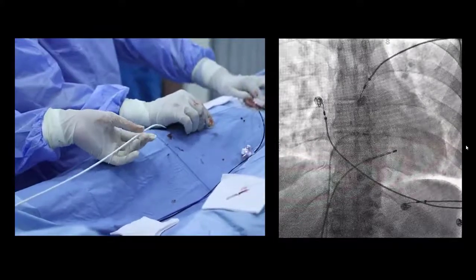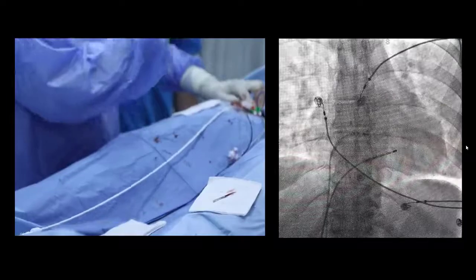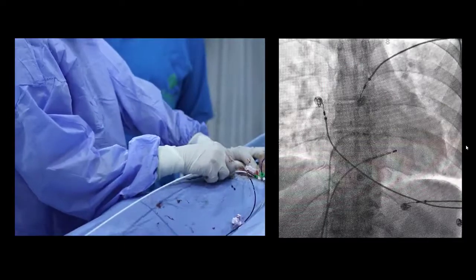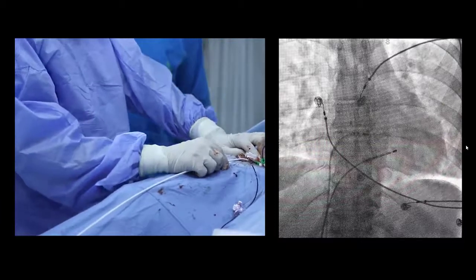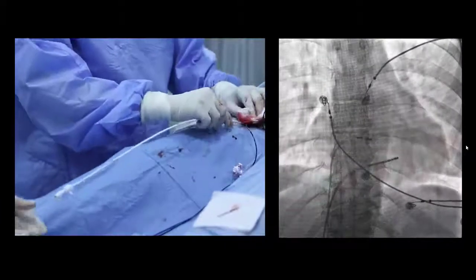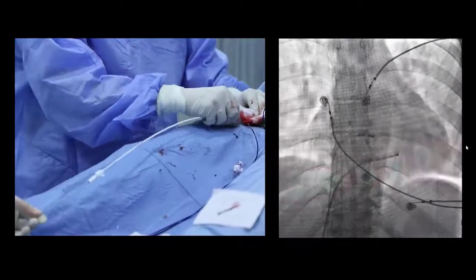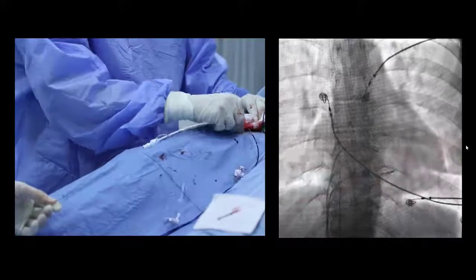We can see here the preparation for the transseptal puncture via long wire and SL0 long sheath, Mullins sheath. We can see the wire. We try to get the wire into the left subclavian.